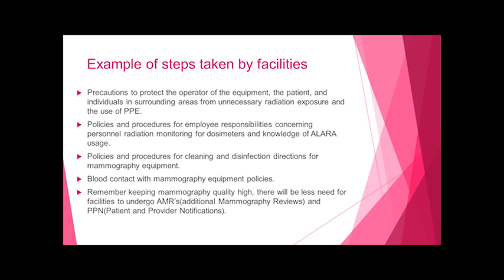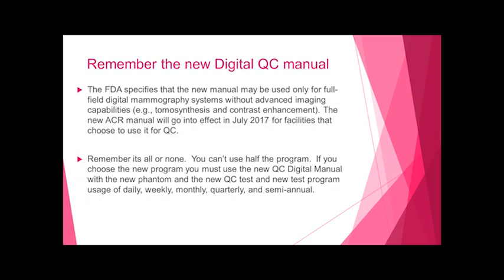Remember, keeping mammography quality high means there will be less need for facilities to undergo an AMR, or additional mammography review, and a PPN, which is patient provider notification, which can be very embarrassing for your facility.